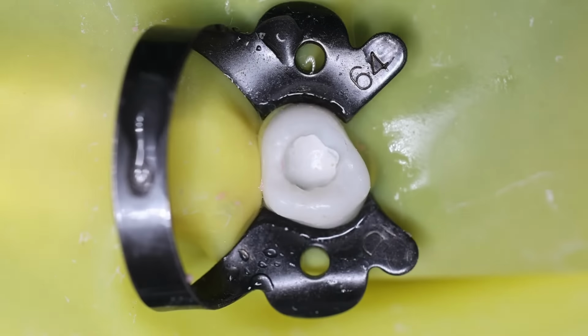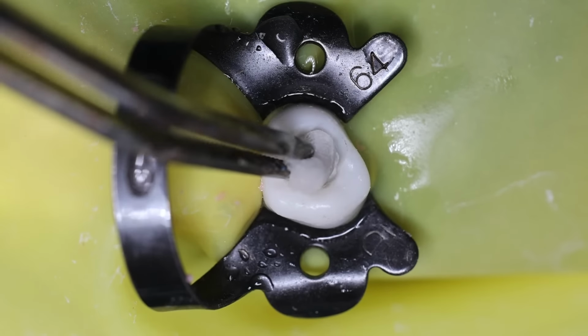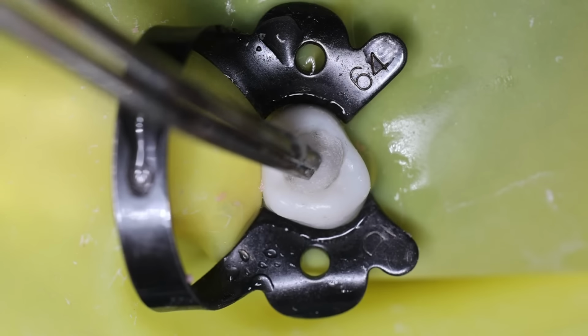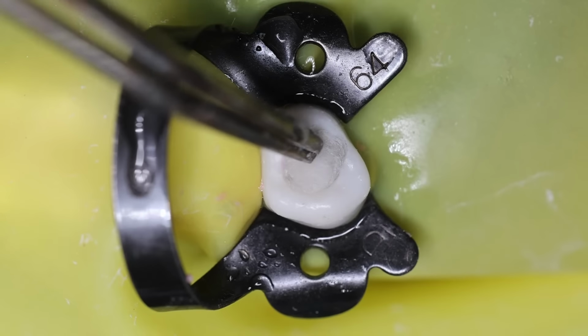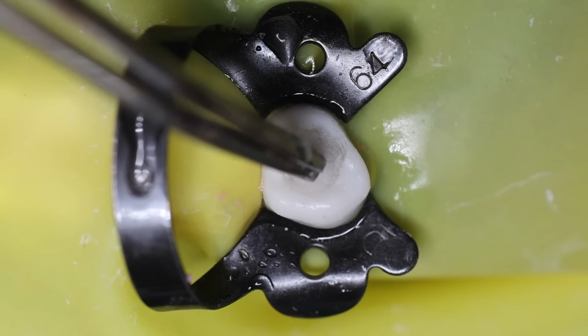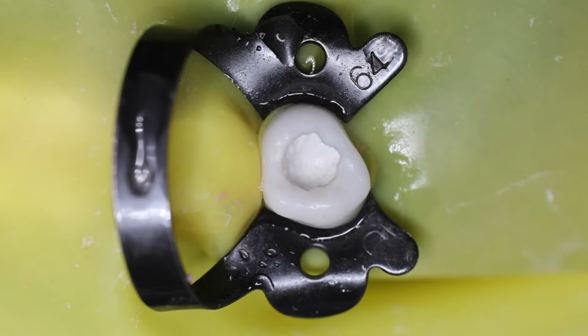Soak the excess water that is there in this moist cotton, and now place it into the cavity. Still there is a little more water, so we will just squeeze out the moisture that is there in this cotton.